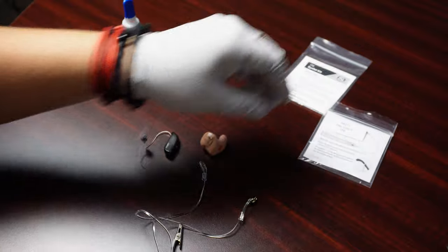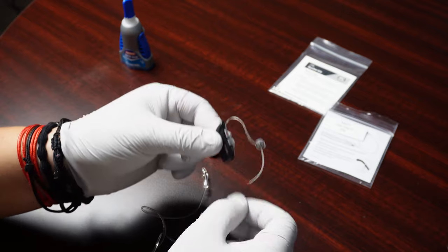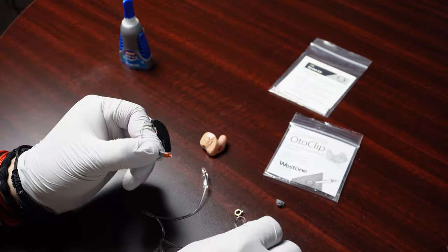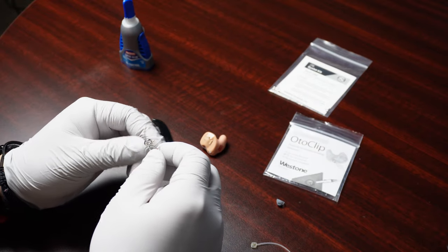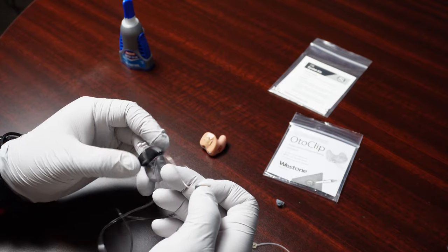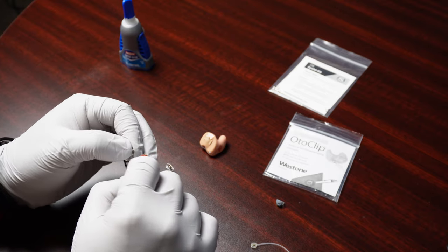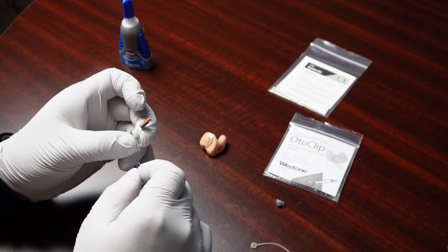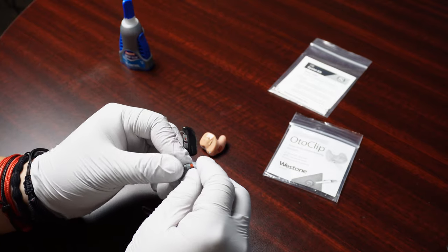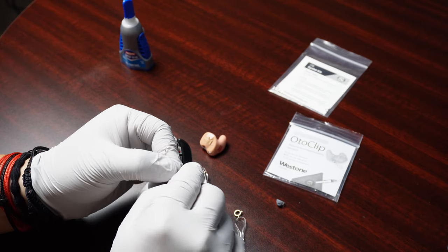Now, just in case you bought one of the Otoclips for the BTE or RIC hearing aids, I'm going to show you guys how you would attach those. We'll just pretend that this Otoclip is made for the RIC hearing aids. And you just take these little loops and you put it around the hearing aid. There's several ways that you can loop it. Just make sure it's attached well and it doesn't slip out, and you should be good to go. But it basically goes on the same way as an eyewear retainer, a neck cord, whatever that lanyard is for your eyeglasses. It goes on the same exact way. You just take off the dome, take off the sport lock, slide the loop over, and then replace the sport lock and dome, and you should be good.